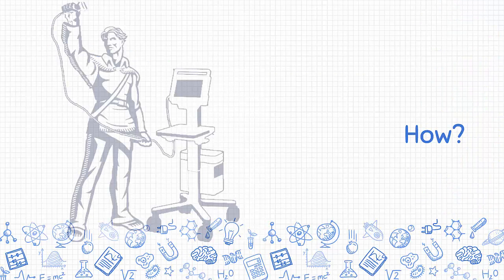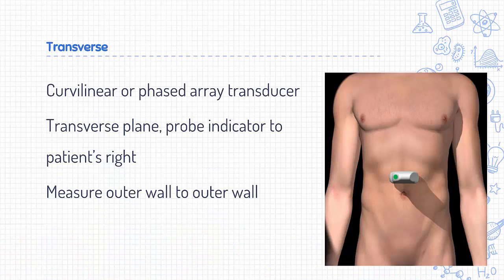And now finally, let's discuss how to perform the exam itself. For this exam, you're going to start with the curvilinear or phased array probe in the patient's midline, just below the xiphoid, high in the epigastrium. You're going to hold the probe perpendicular to the patient, aiming straight down. The left lobe of the liver typically provides a nice acoustic window to find the aorta. Once the aorta is identified, slide the probe down towards the patient's umbilicus, carefully measuring the entire aorta visually.